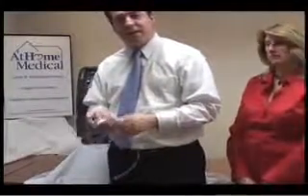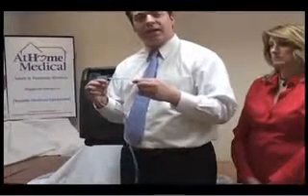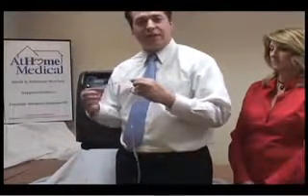You have been given a nasal cannula. The nasal cannula is an accessory that delivers low flow amounts of oxygen. In order to receive the adequate amount of oxygen, it's important that you use your oxygen equipment properly.